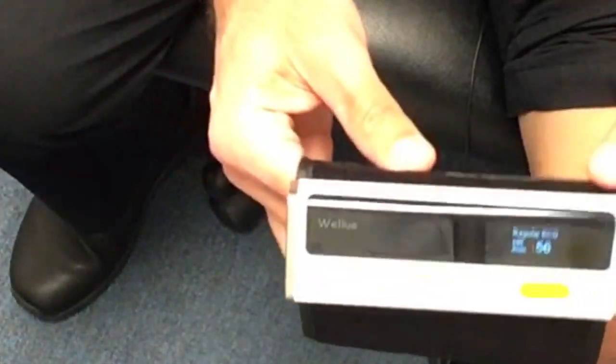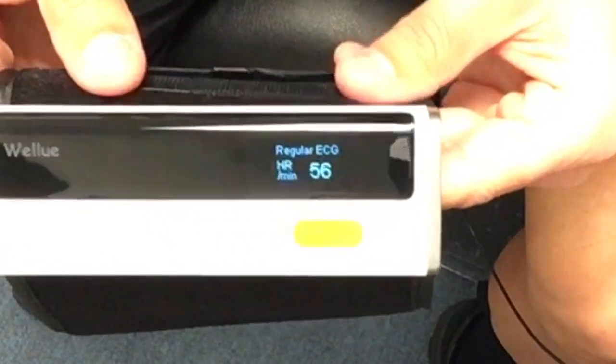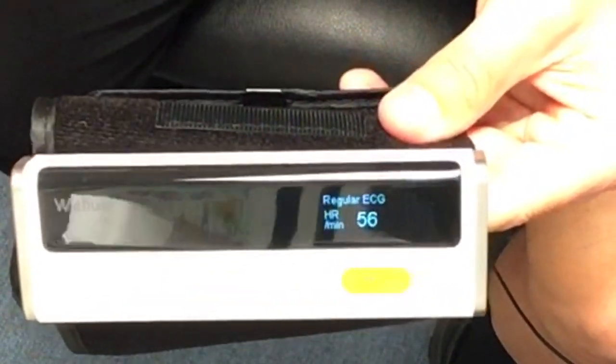You can see it measures a 56 pulse right there and tells you that you're having a regular EKG — so you're good.